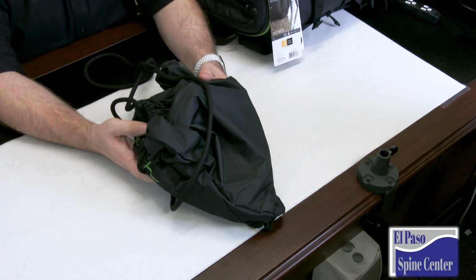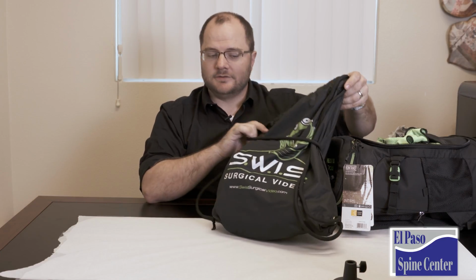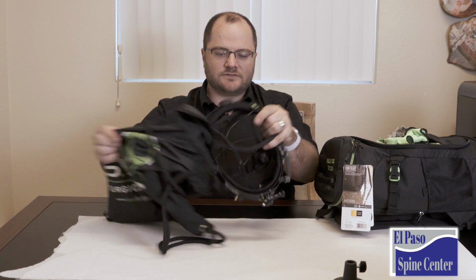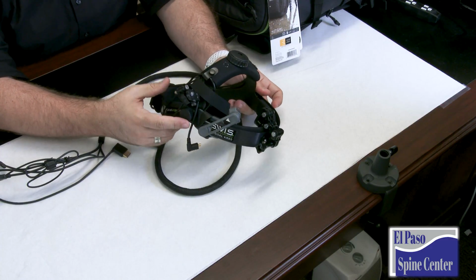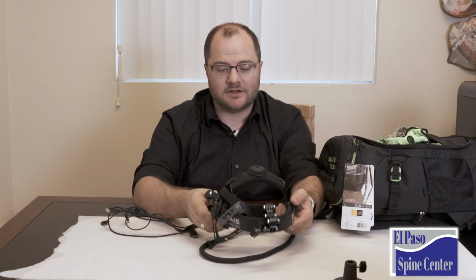And this bag right here, besides being a SWIS Surgical branded backpack, actually contains the main headpiece for the unit. The headpiece comes pre-assembled with all the cables you're going to need, but what each of those cables do and where they attach kind of threw me for a little bit, which is one of the reasons I wanted to make this video.